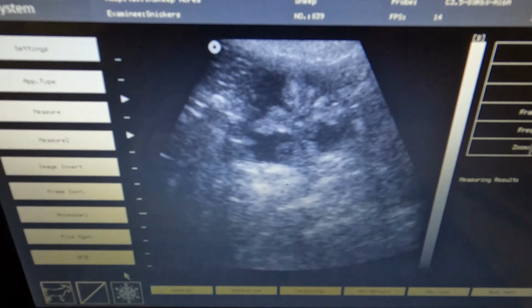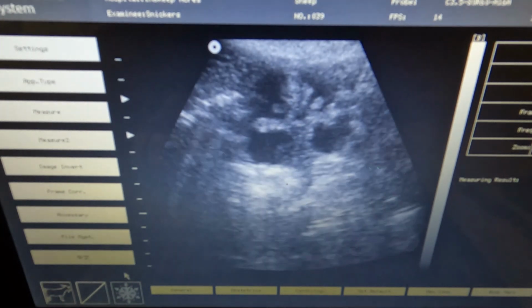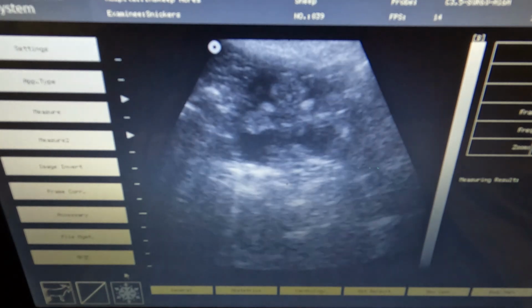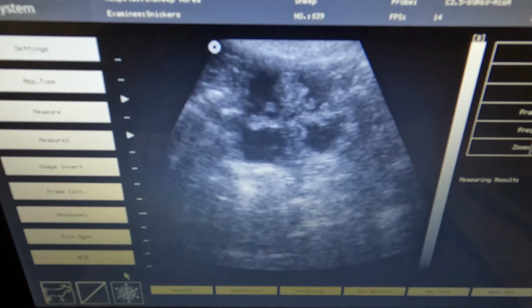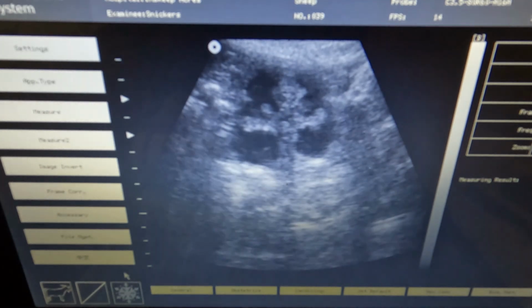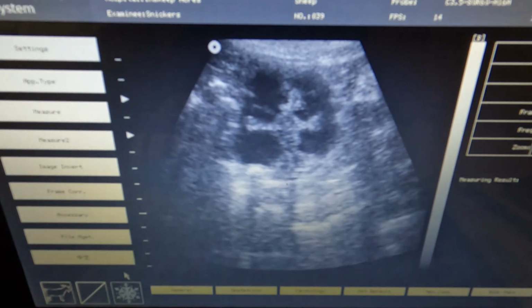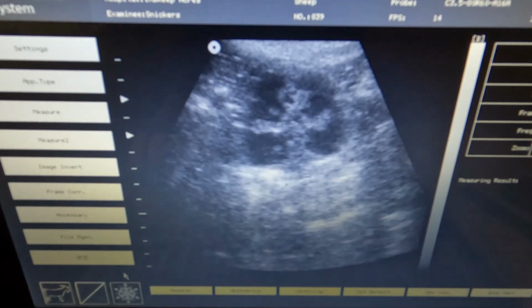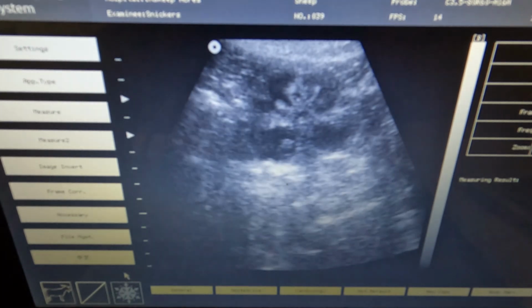One, two. No, I'm not sure. I believe there's at least 3. Trying to see if there's anything in the bottom right bubble. Yeah, I believe I see a little bit of movement in there, so she may be like her mom, Sangria, and have 4. Oy vey. She's not a really big doe, though.